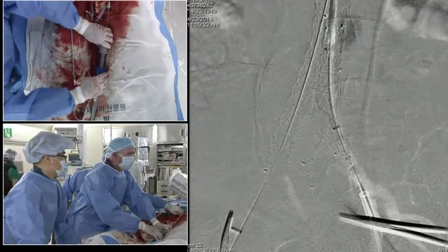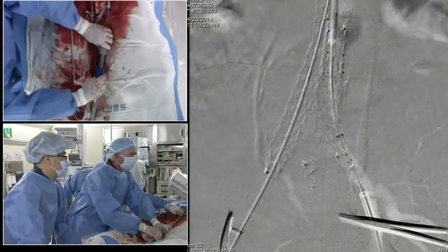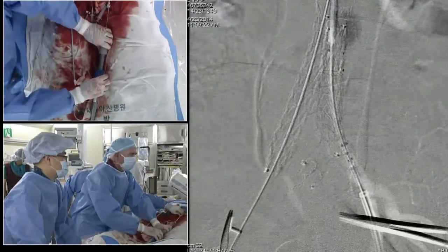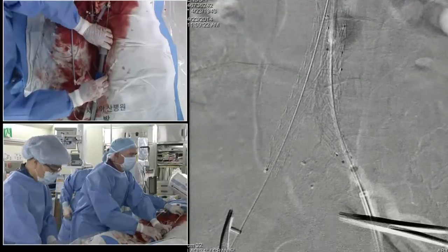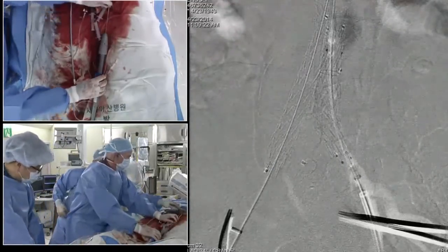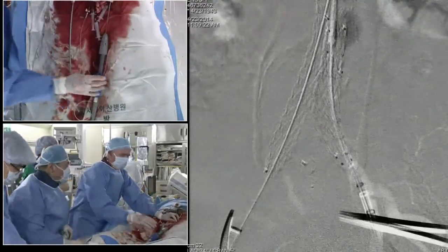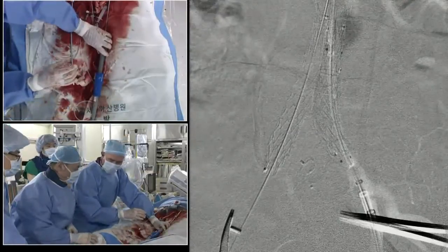I think we're okay. It's creeping up just a little bit. We've lost a little bit of our length there, which may be okay. Okay, great. Thank you. Okay, so we'll pull down the nose cone now. We can get rid of our roadmap.